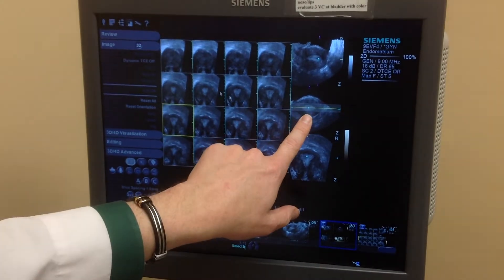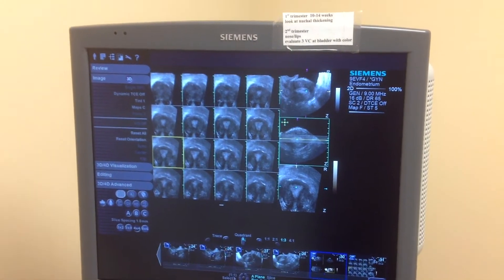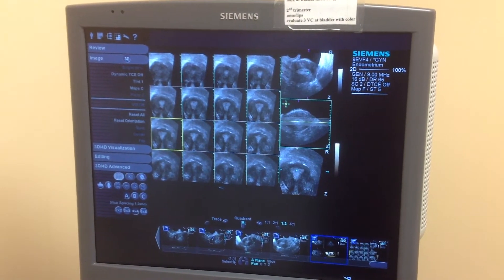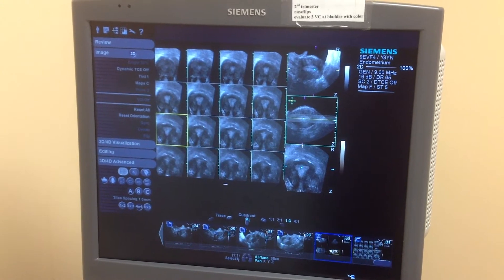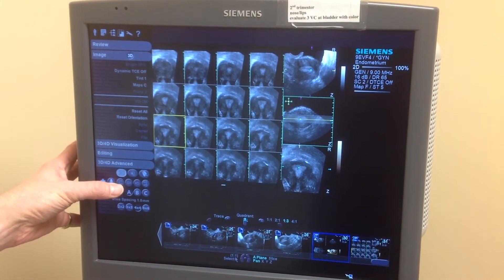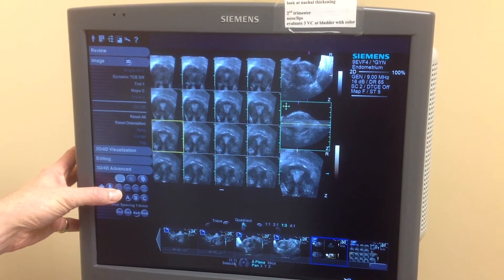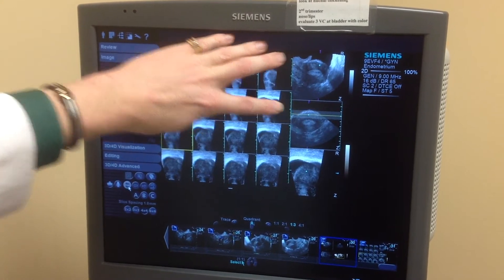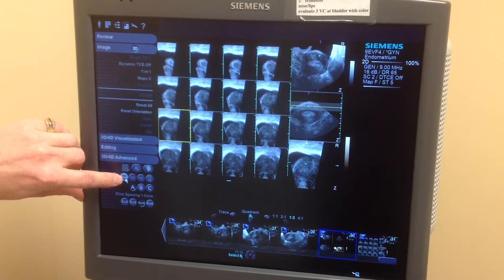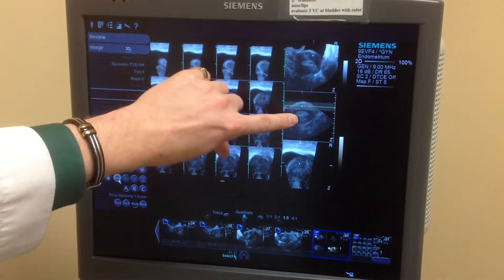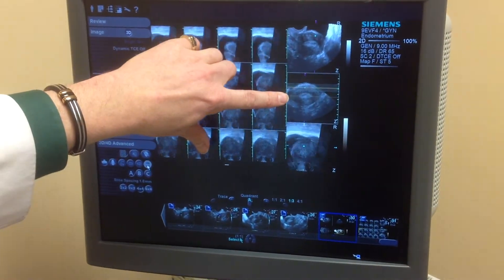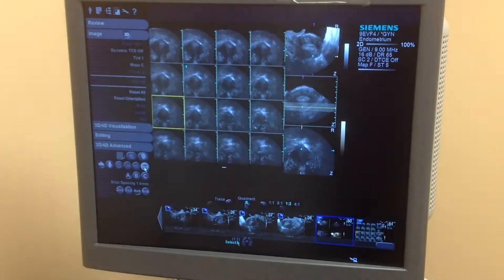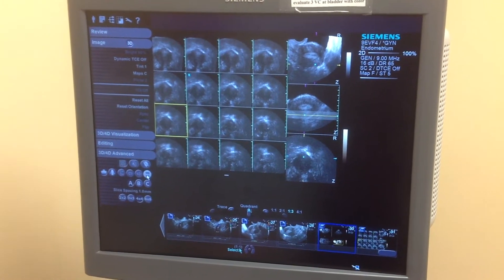To activate this over here, just click on it with the select key, and you can move the slices up and down if needed. Note that the radiologist cannot manipulate these at their workstation — they're just going to get the images that you take. So you can click on the arrows and take all the different slices. Clicking the double arrow jumps up to the next section; clicking the arrows on the other side moves down. Each click jumps to the next section of the image.